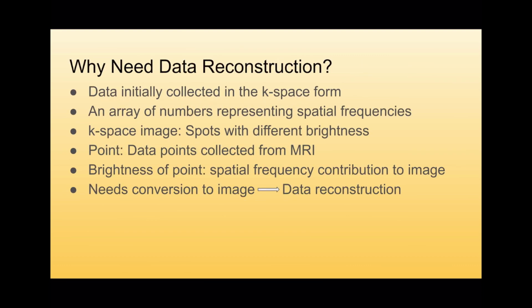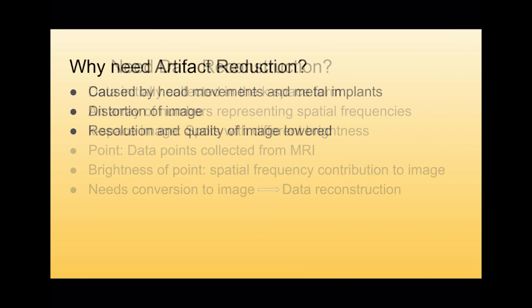We need to reconstruct the data of MRI images because the data is initially collected in K-space, which is an array of numbers representing spatial frequencies. We need to convert the K-space data back into an image.